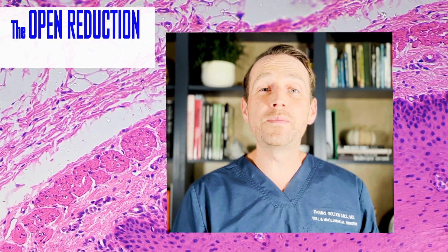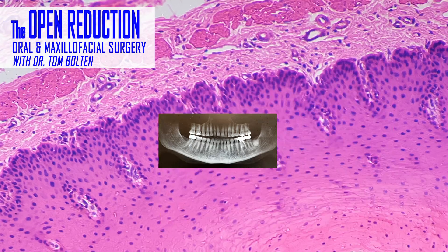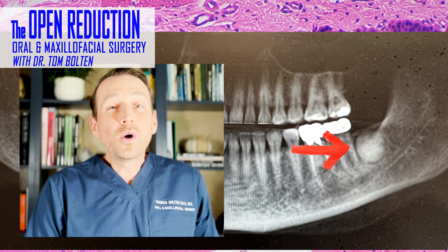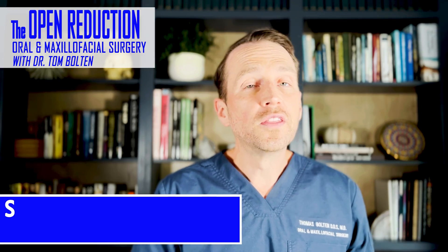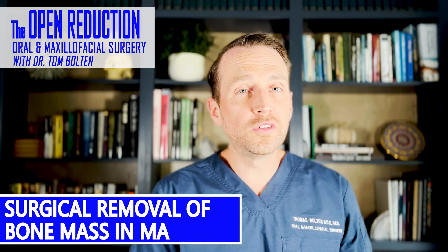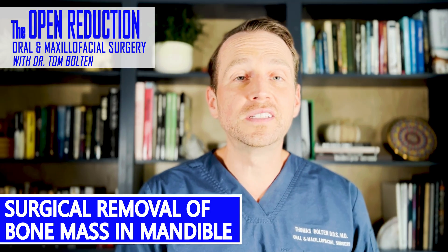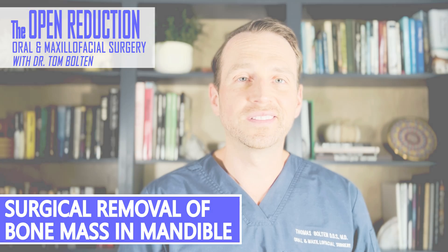A 45-year-old female comes in with a white mass on a panoramic radiograph. What's the next step? Part two: the surgical removal and management of this lesion, today on The Open Reduction.